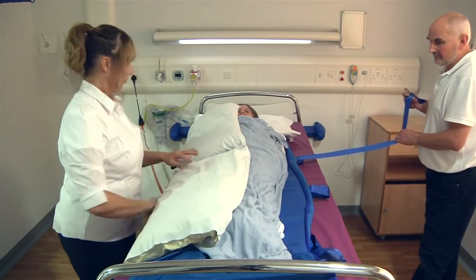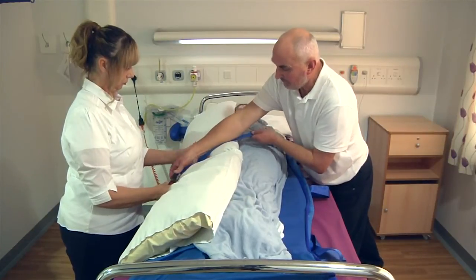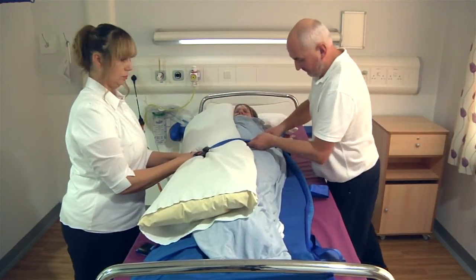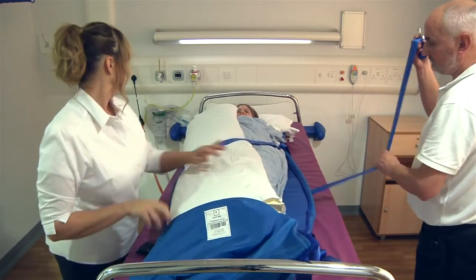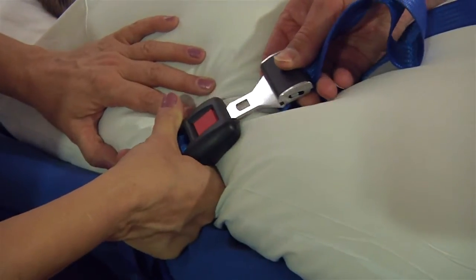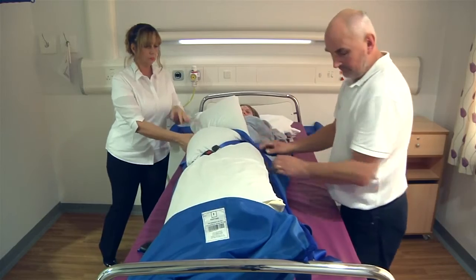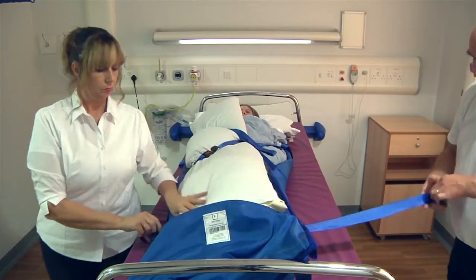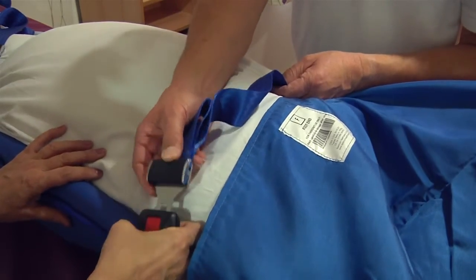Working in pairs, secure the cross straps in a diagonal position and tighten to cocoon the patient on the ski sled. The straps need to be tight but comfortable for the patient. To prevent tripping, ensure the loose strap ends are tucked under the cross straps.